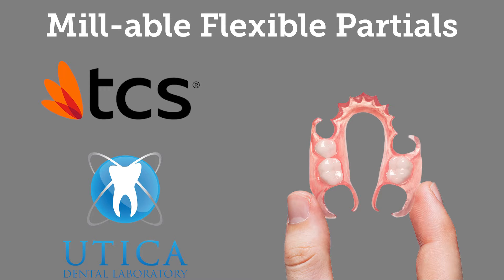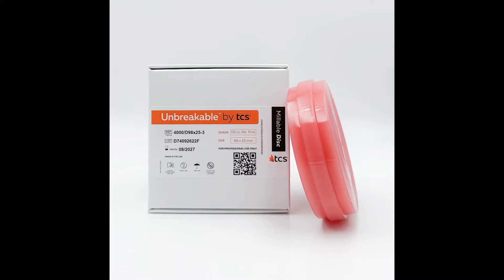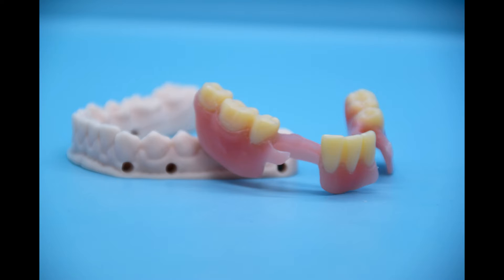Introducing new Millable Flexible Partials by TCS. Made using TCS Unbreakable Millable Discs and 3D printed denture teeth, Unbreakable is an extremely resilient, high performance, nylon thermoplastic, popular for its unbeatable strength and exceptional memory.